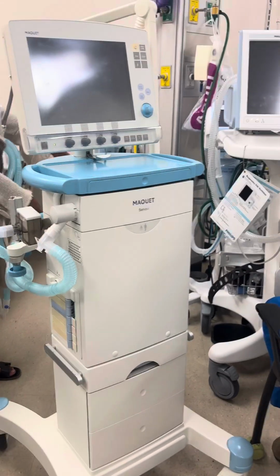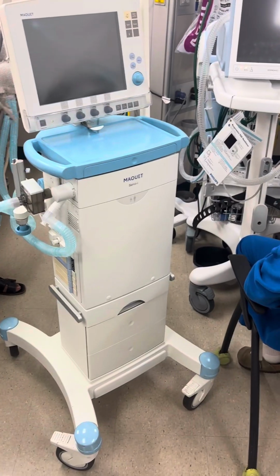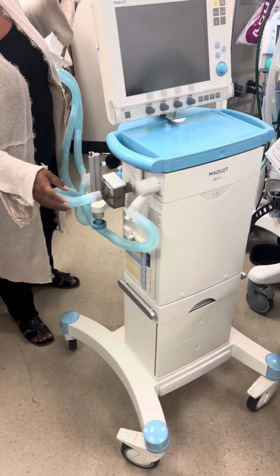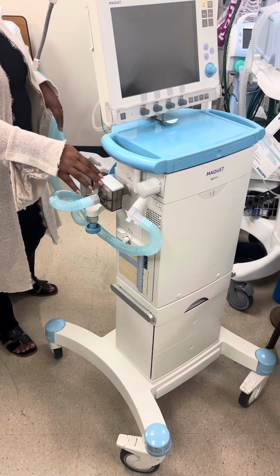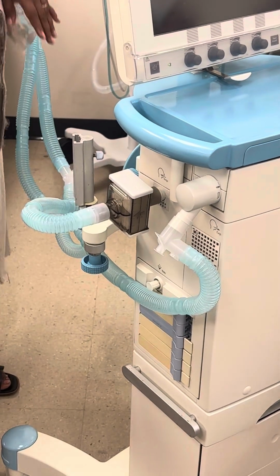Your electrical hose for your red outlet. So everybody see this? You can follow the lines and see that it's already hooked up there. You have your circuit here. This one actually has different filters. Like I said, this looks different than that one. But you still have your universal circuit and you have external filters.